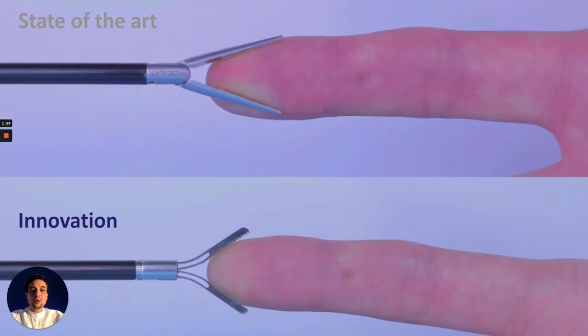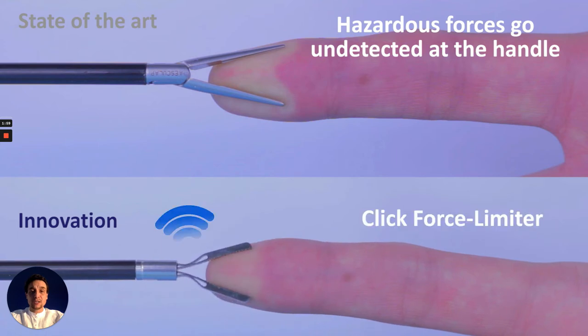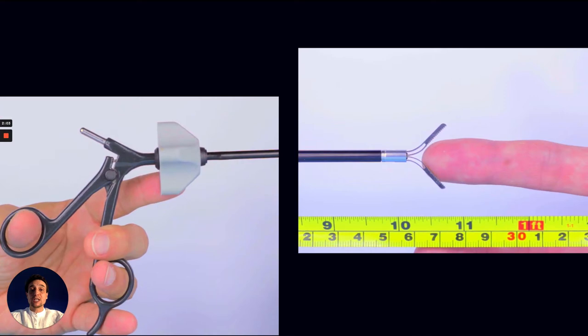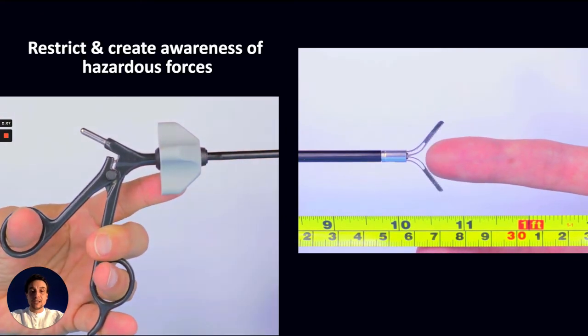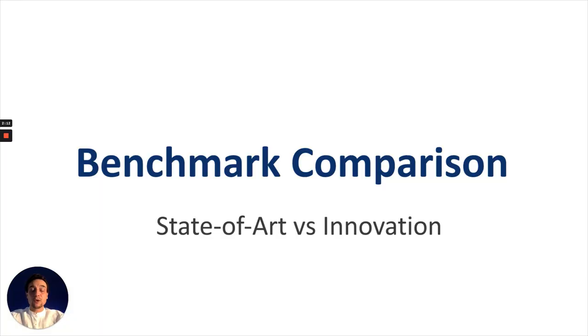It's been reported in literature that hazardous forces can go undetected at the instrument handle when using state-of-the-art. Our multi-modal mechanism is customized to buckle upon reaching a predetermined maximum pinch force, which can be felt at the handle. This feature can prevent and create awareness of hazardous pinch forces before they transfer to tissue.